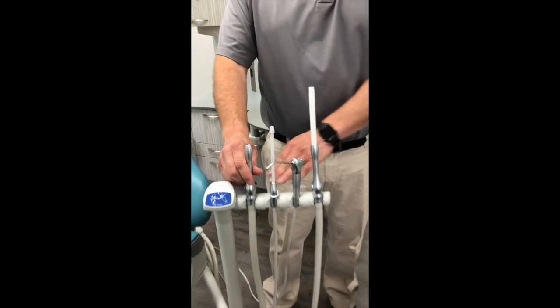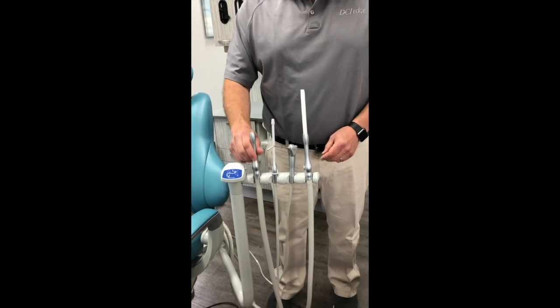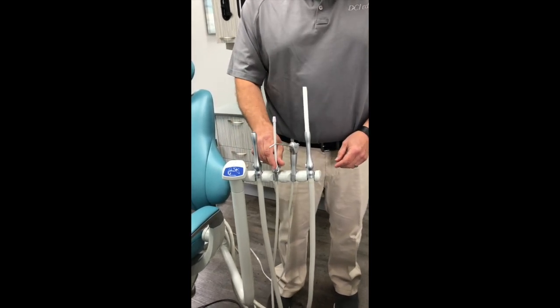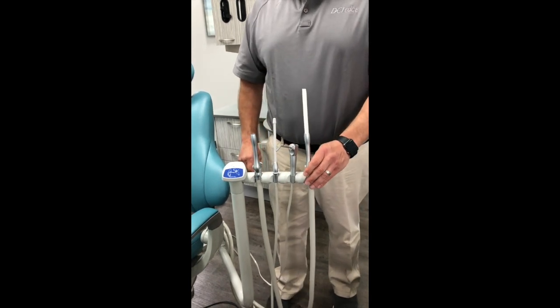You have a four-position assistant instrumentation holder. It's going to come with an HVE, a saliva ejector, a three-way syringe, and an optional second HVE.